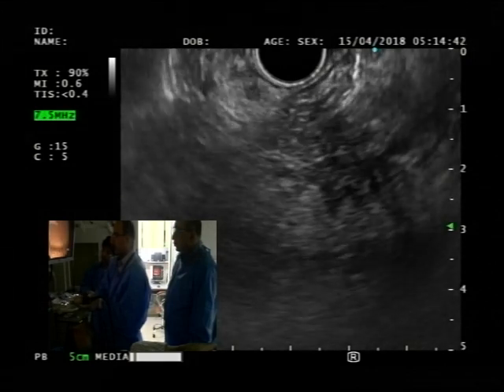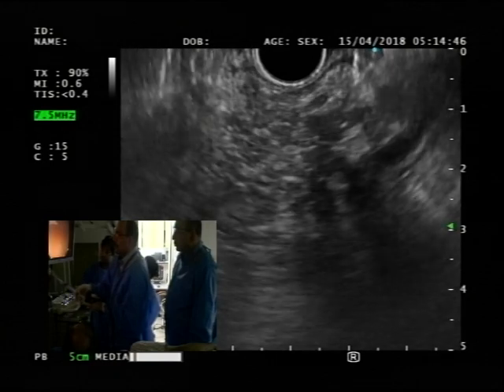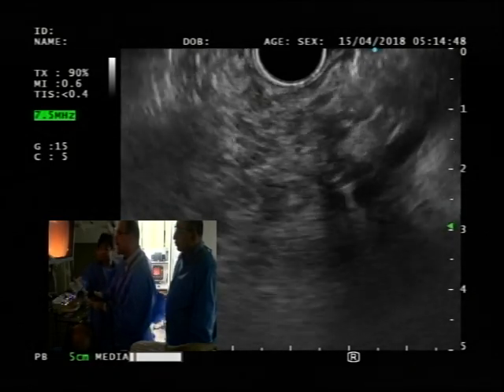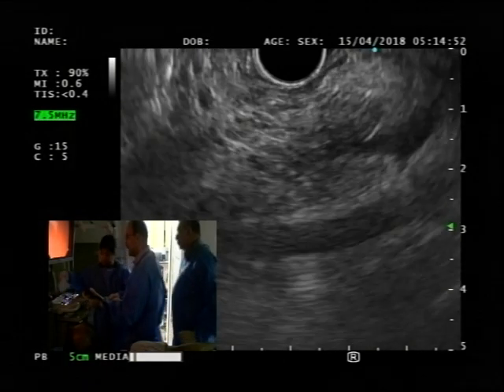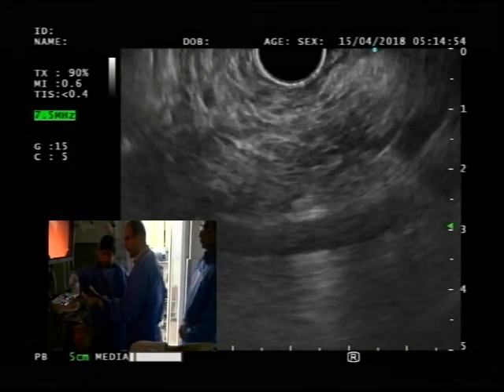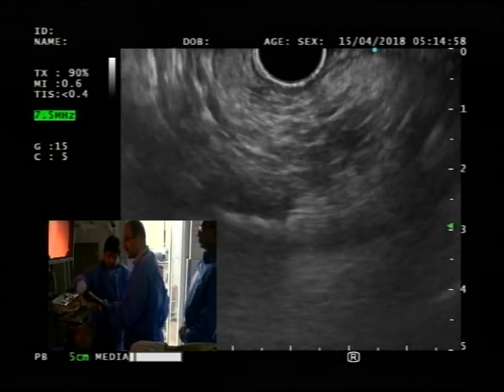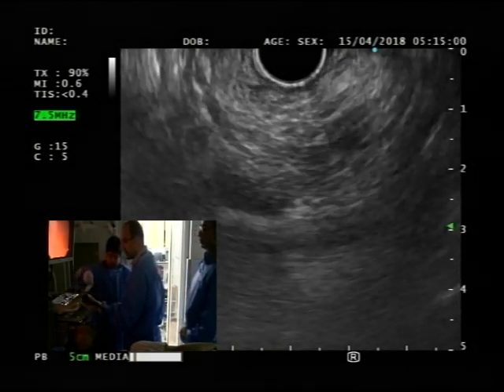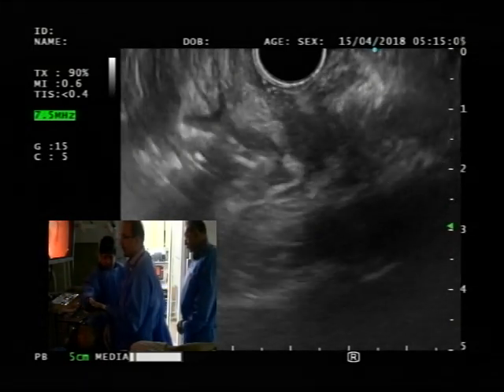We're in the lesion. How many passes do you make, Dr. Mustafa, in a single go? About 15. I didn't count. I was focusing on the area, but generally speaking, about 15. No more than 20, because your return goes down. I just noticed in the needle that there was a bit of blood, so we'll see how bloody this specimen is. The more you do, obviously, the more bloody it'll get.